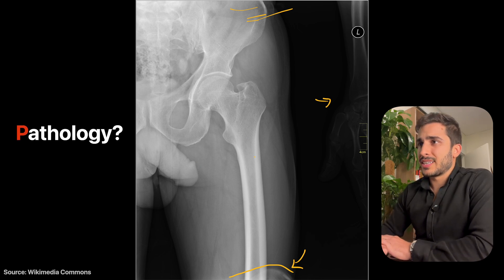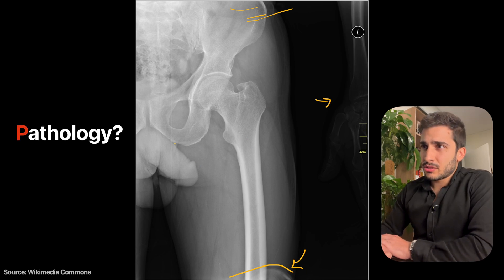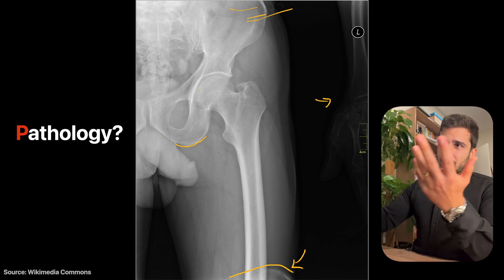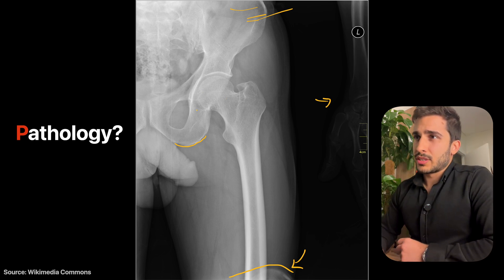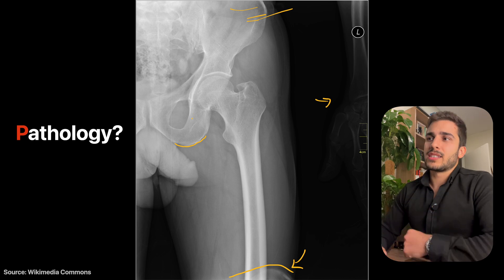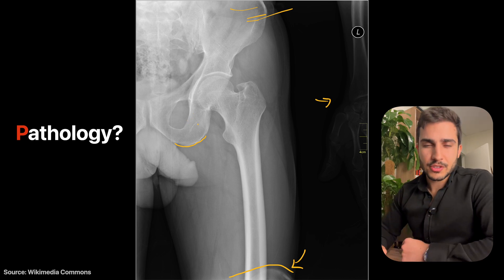In terms of pathology, there are no major fractures visible. There are some irregularities around some of the bones, which are usually signs of arthritis or early arthritis. It's hard to confirm without comparing to the other side or having more severe radiographic signs. Hopefully that made sense — let's move on to the next one.